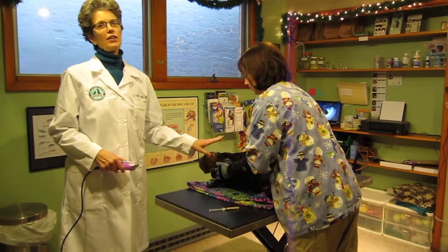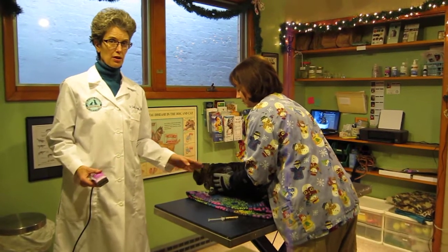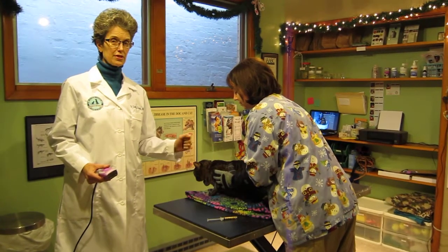Rachel here is wearing the gloves. These gloves are a little bit small for her — we just had the one size small. She wears a slightly larger glove size than myself.